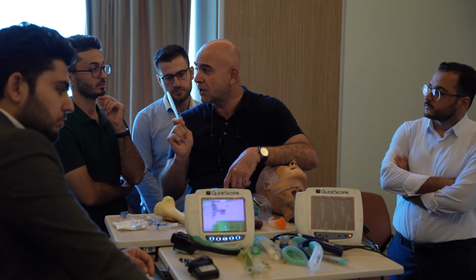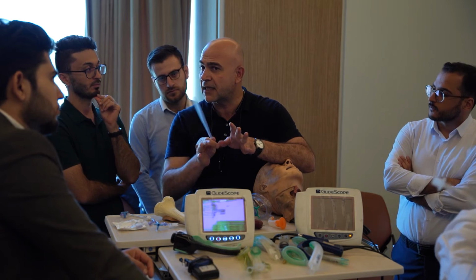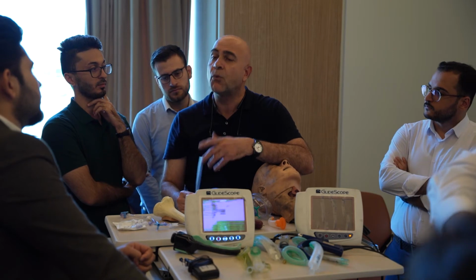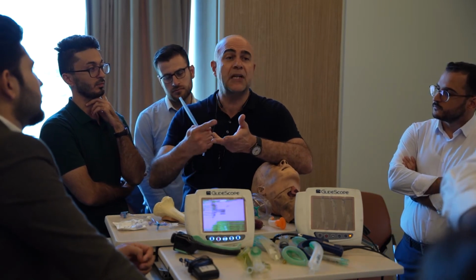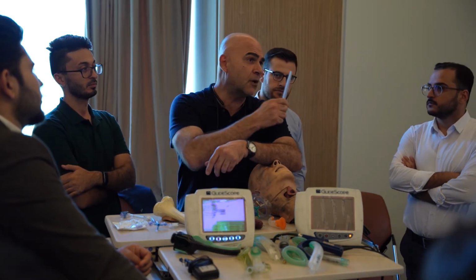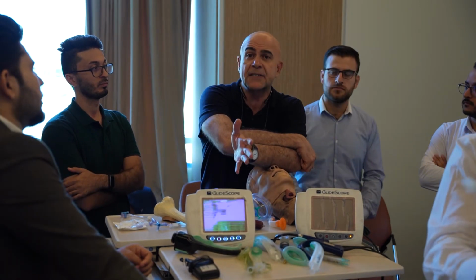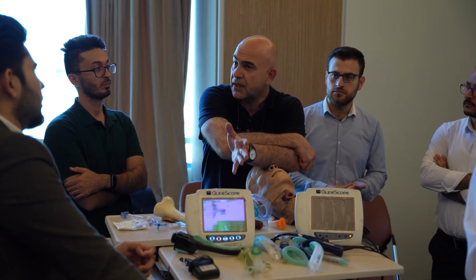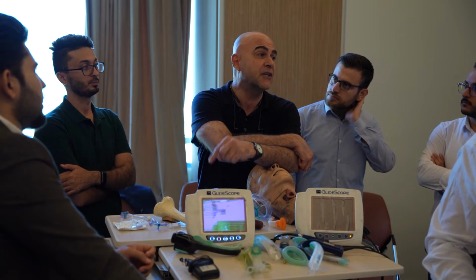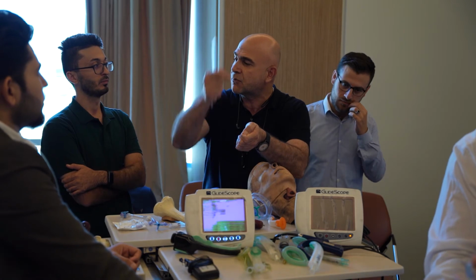It is not necessary to do intubation throughout the CPR. You are just satisfied by doing basic life support. The maximum is to put in an LMA. Why? Less complication, less morbidity, less mortality, easier, and you are not wasting time. When are you going to do intubation in cardiac arrest? If chest compression is in progress, continue; you cannot do intubation. So you are going to intubate when they are checking the rhythm, after 2 minutes. Meanwhile, the intubation should be done like that.